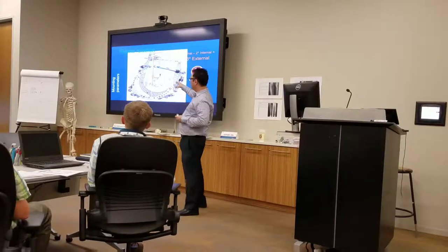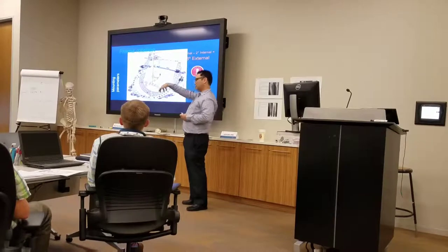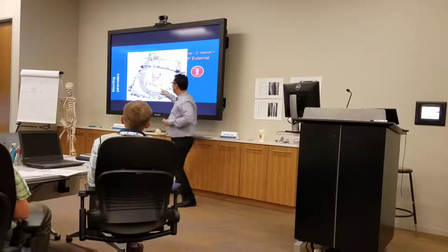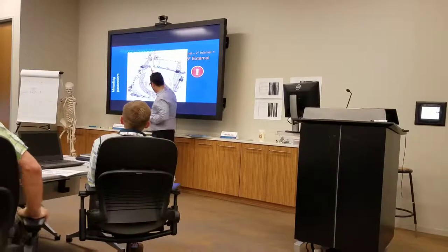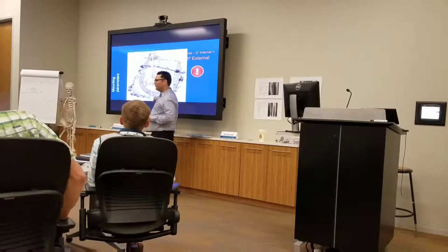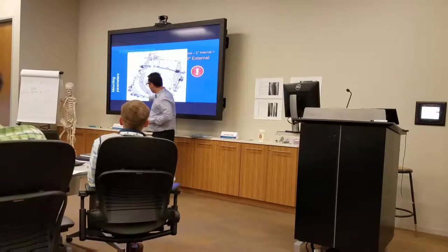You have to look at this frame as if it's on a long leg, but upside down and twisted. That's how you have to look at the frame. That means this is not tab 1 and 2. Tab 1 and 2 are in the back over here. So basically, tab 1 and 2 start in the back over there.